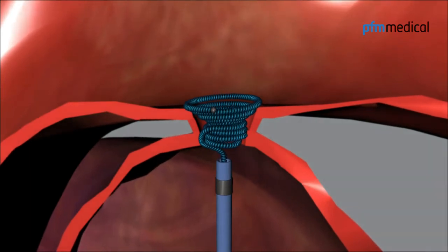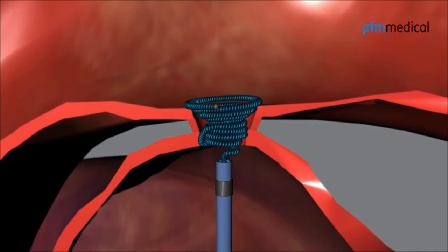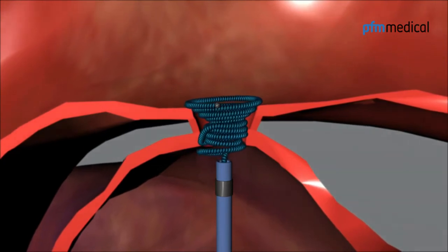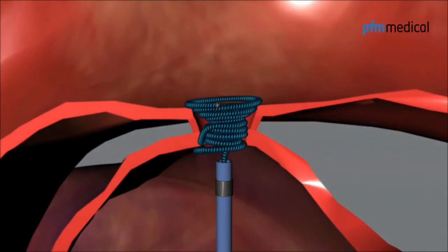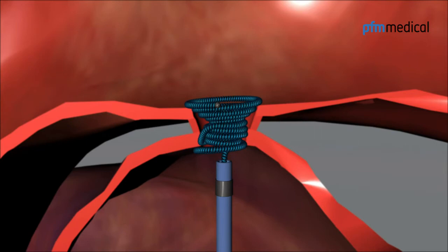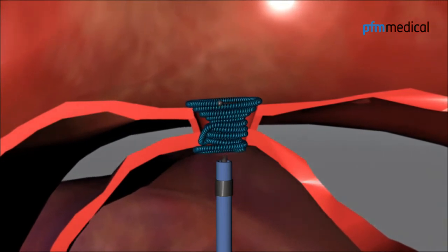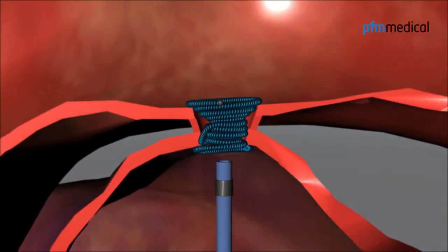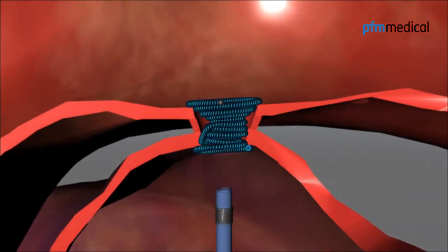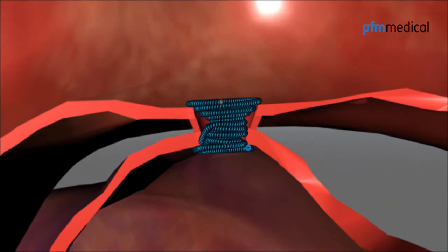The last one or two loops are configured on the pulmonary side of the ductus, anchoring the coil on the pulmonary side. At this point the coil is outside the catheter. The rotation handle is used for release. The implantation catheter and delivery system are then removed.